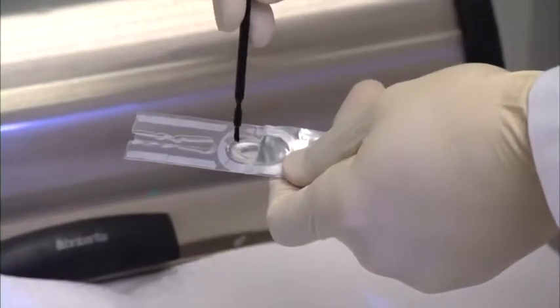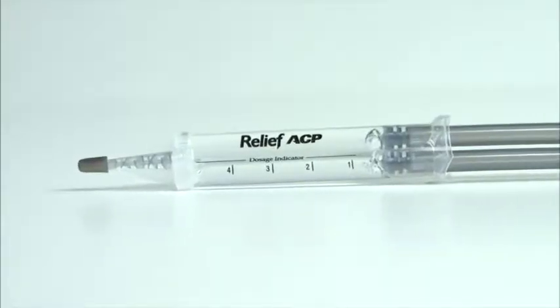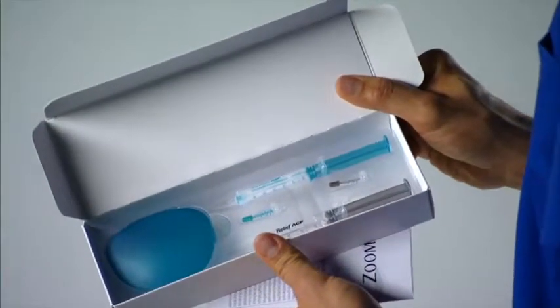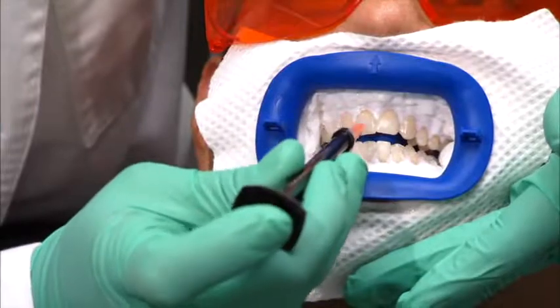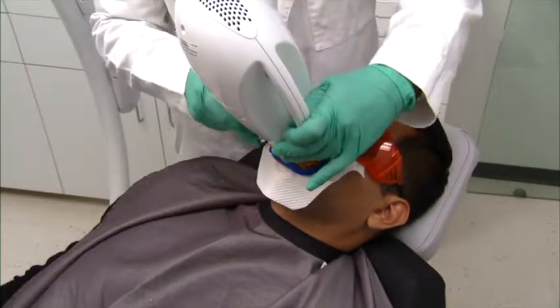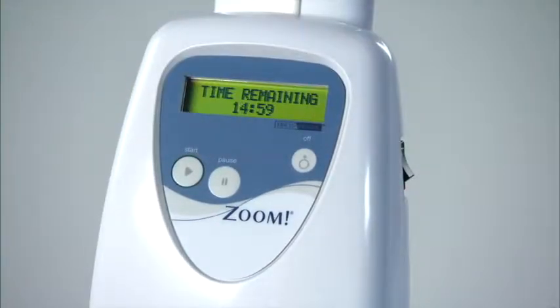If the patient notes tooth sensitivity, apply the Relief ACP gel on lingual surfaces for remaining sessions. The Relief ACP gel is provided in the patient post-care and maintenance kit. Reapply the Zoom whitening gel. Align the light guide to the IsoPrep retractor and begin the next session by pressing Start. Repeat these steps for each of the 3 sessions.